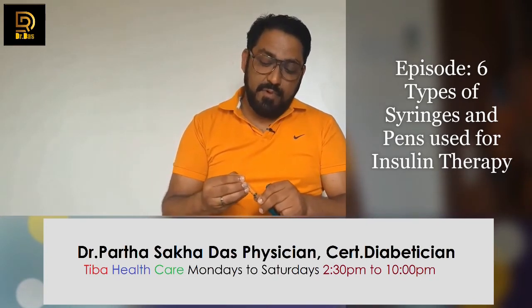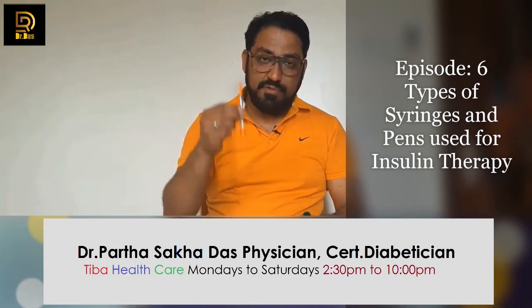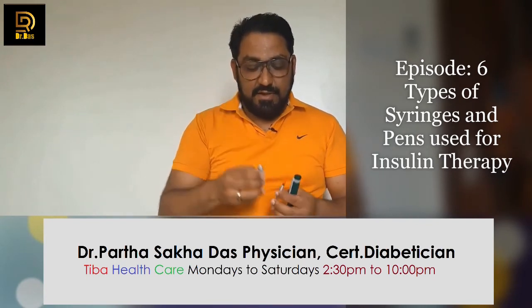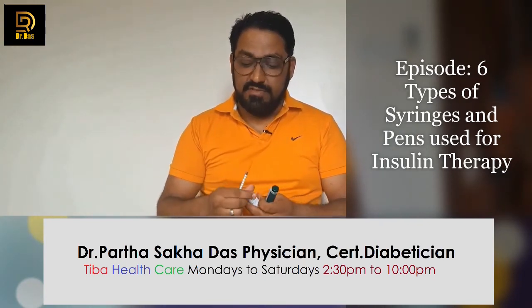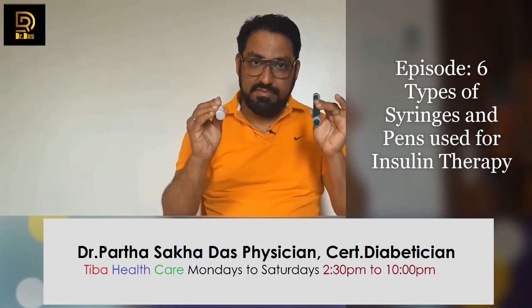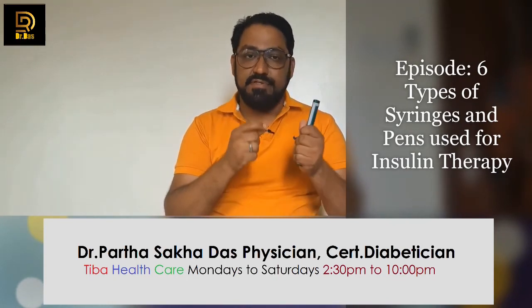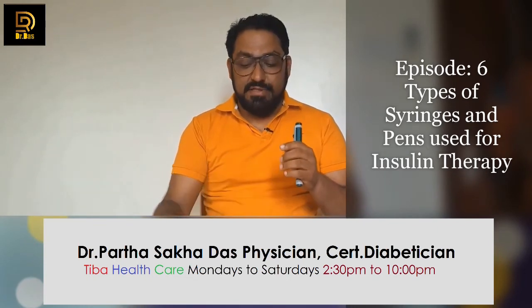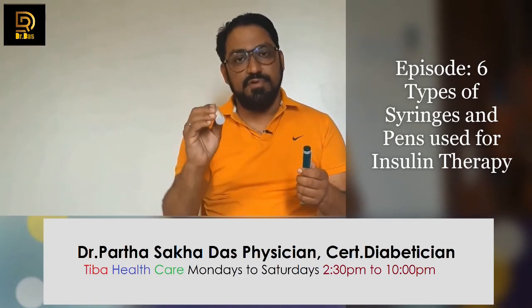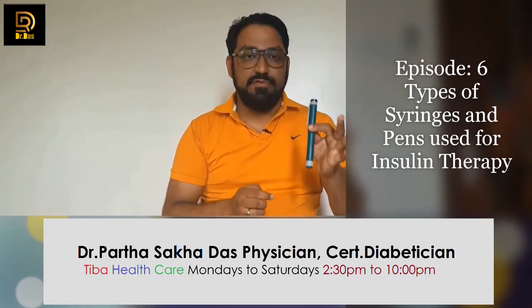Now there are pros and cons to using these two, the syringe and the pen. With the syringe, you have to take the vial, draw the insulin and inject. If you compare, you get more insulin in a vial, and it is economically much cheaper, because people don't feel as comfortable with this, so it is cheaper. You get more insulin at a cheaper price. With this one you get lesser insulin, but it is very easy to use.